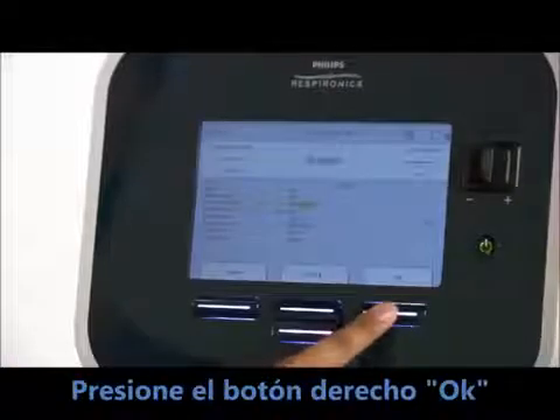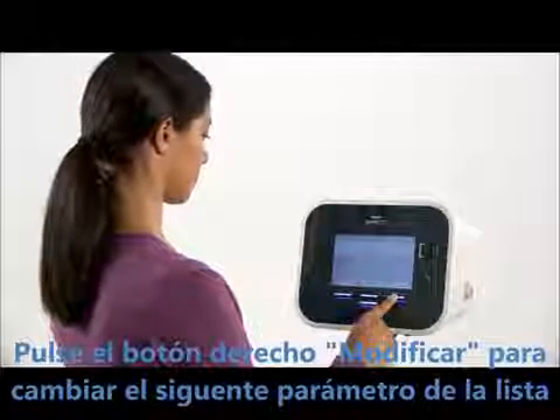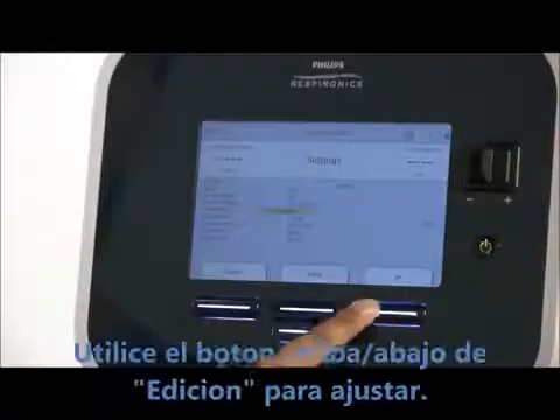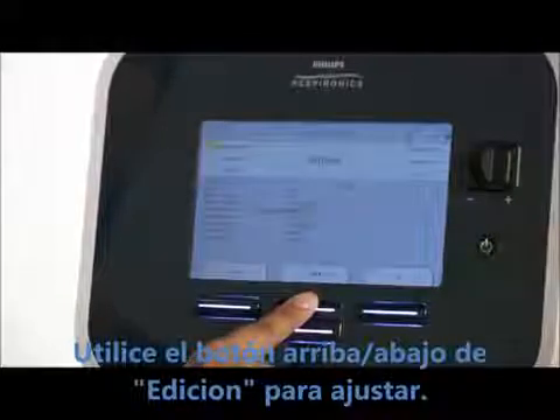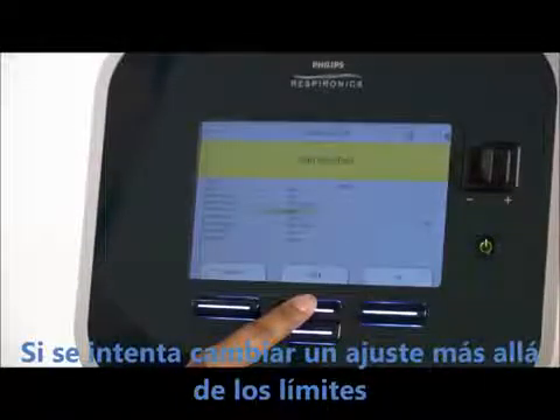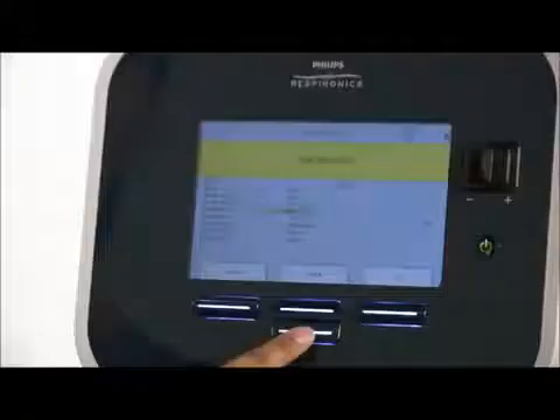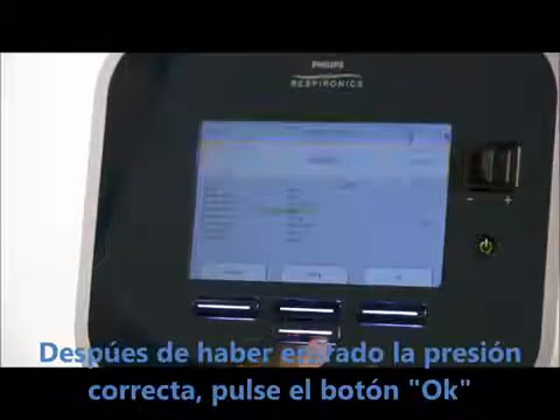Press the right button under OK. Press the right button under modify to change the next item on the list, which is inhale flow. Use the up-down edit button to adjust. If you try to change a setting beyond the available parameters, a limit reached message appears. After you have entered the correct pressure, press OK to accept the new setting.